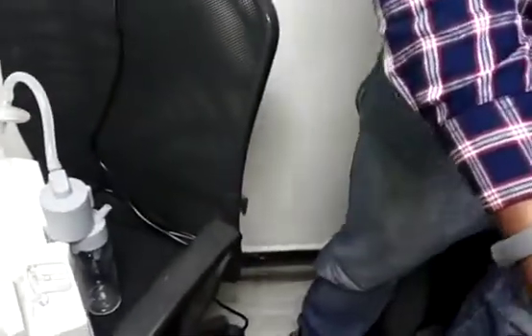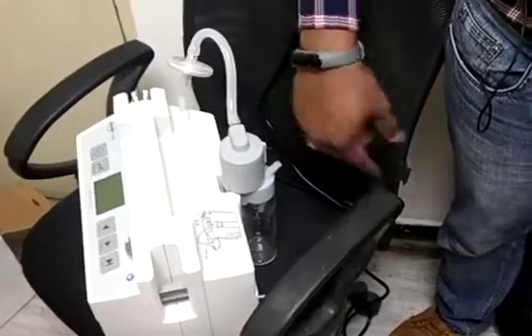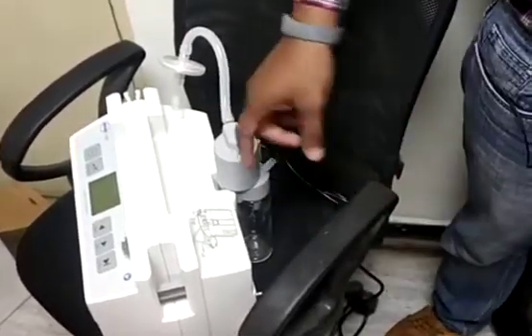Next, one more tube is there — from the safety jar to the main jar. So this is the connection. One more small bit.